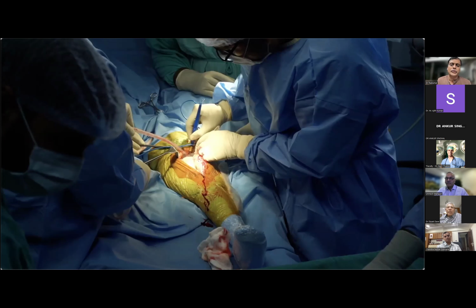So it all varies from patient to patient. We have to take a decision on the table. So we have to be well versed with all the three techniques: static, dynamic, and new implant, so that we can customize according to the patient, affordability, everything. Agreed. So thanks. Great discussion. We'll have to move forward.